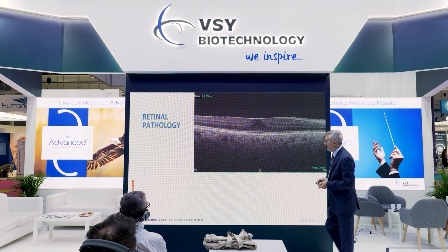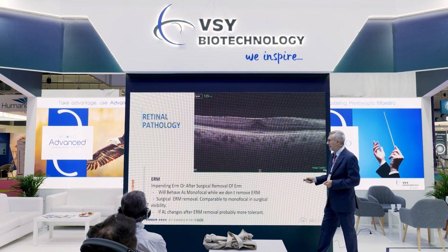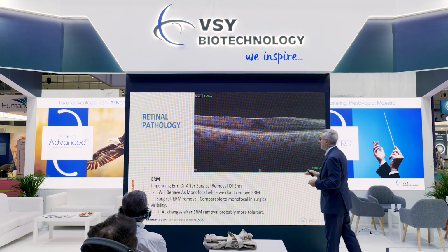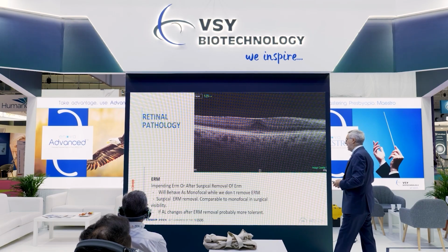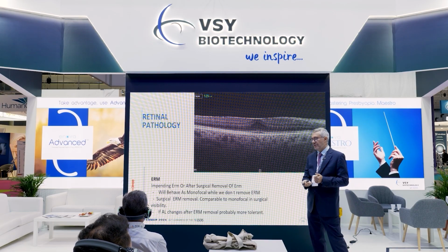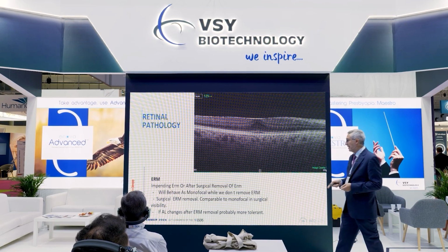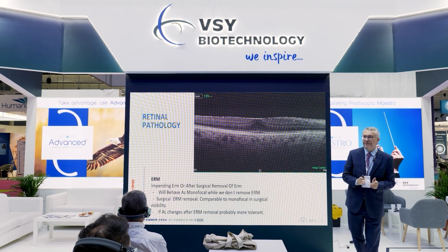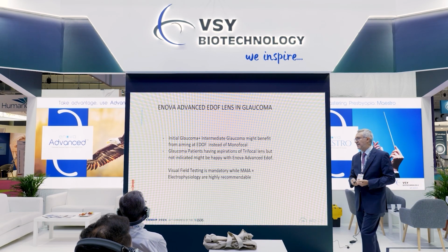And furthermore, this is a patient who was operated on with EDoF lenses, the Enova Advanced, in spite of having an early age-related epiretinal membrane. As far as the lens behaves mostly as a monofocal, and the patient doesn't want to have this membrane removed because he is quite satisfied with the vision, we are confident that if we ever need to peel this membrane, first of all, the view of the retinal membrane for the surgeon is not going to differ much compared to a monofocal. And second, if axial length changes after surgery, although minimally, the tolerance of the wider, broader focusing point of this EDoF lens is going to grant us superior satisfaction.